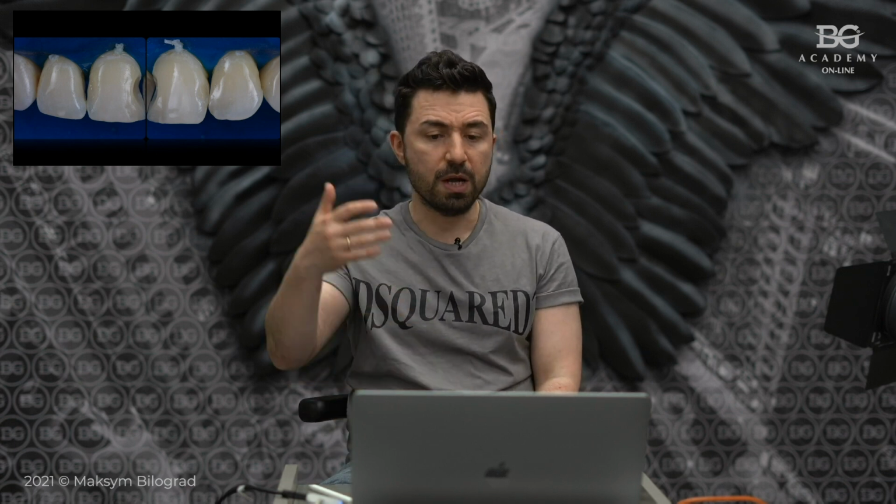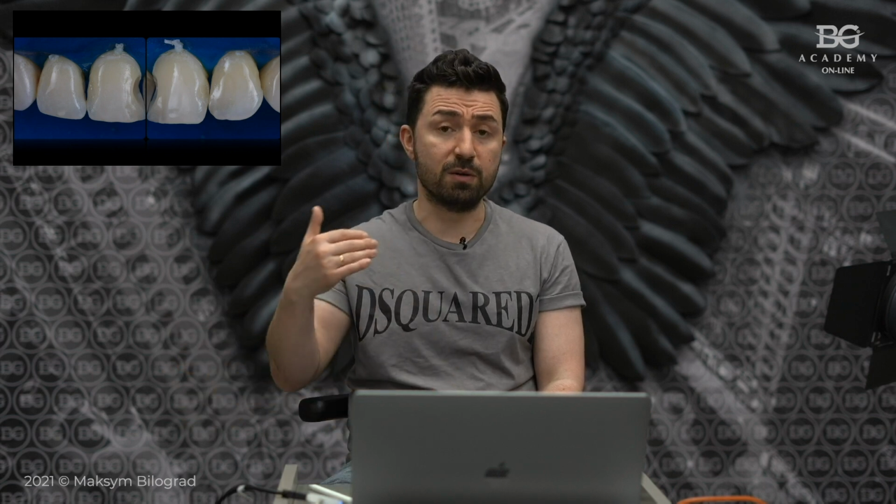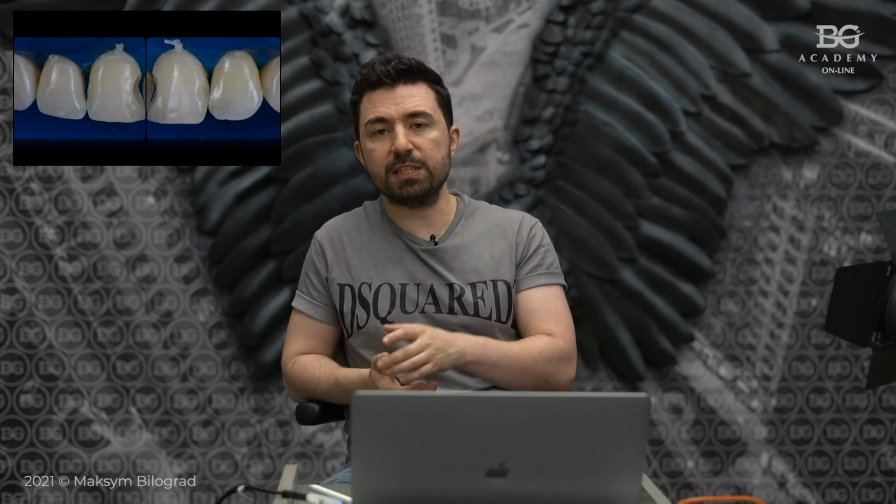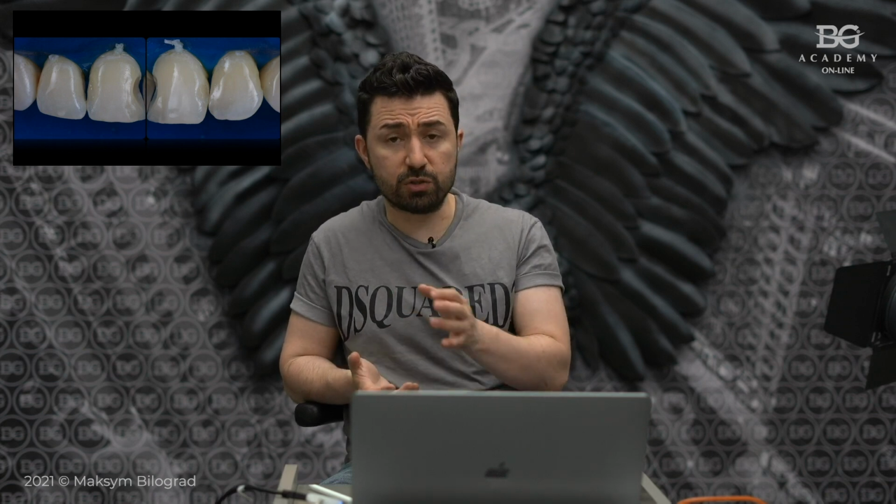composite. For example, our tooth is A1 Vita shade and we decided to use also A1 dentin and A1 enamel. The tooth is A2 and we decided to use A2 composite, like A2 dentin and A2 enamel. Logical. But we placed too much dentin, for example, so the restoration will be white or yellow.